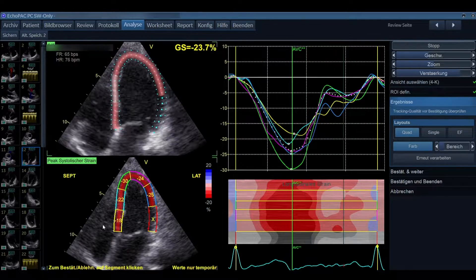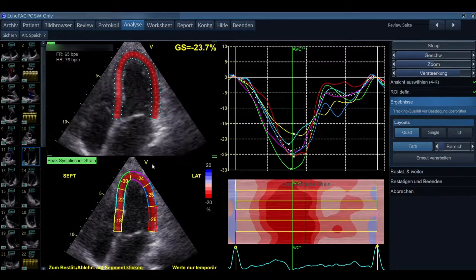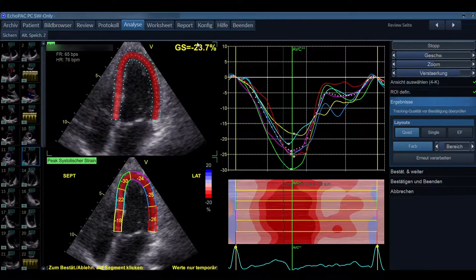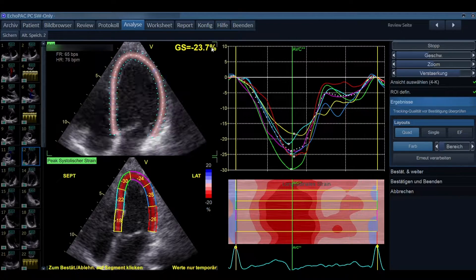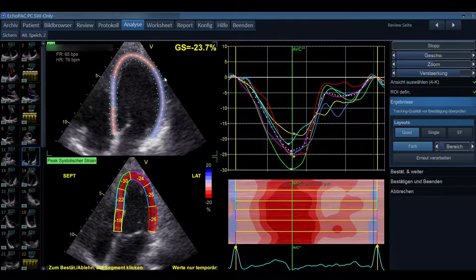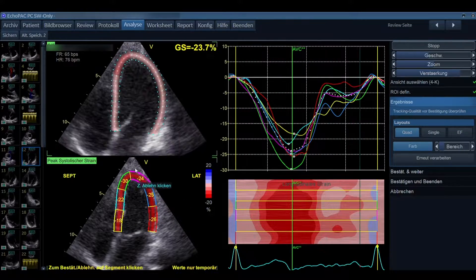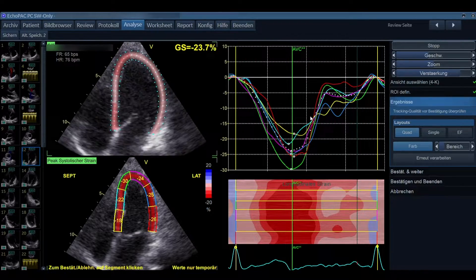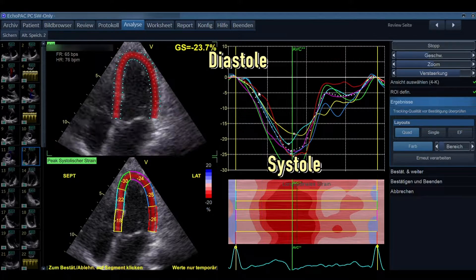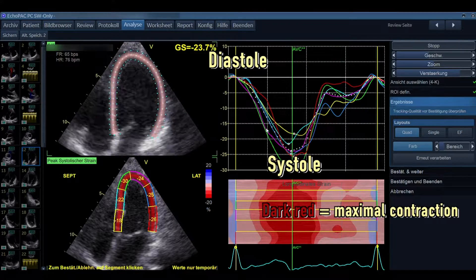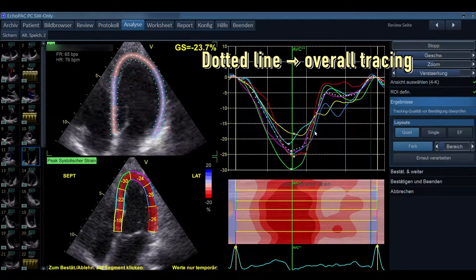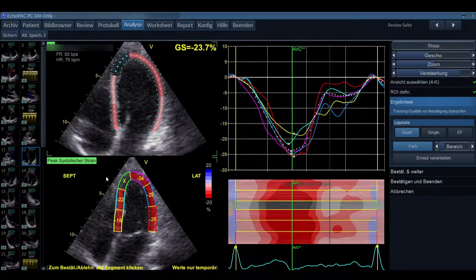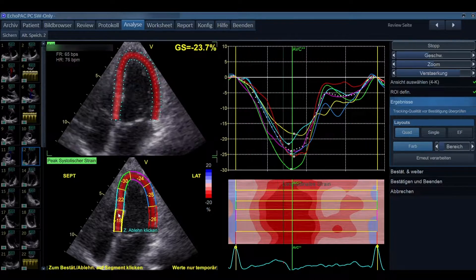Once optimized, we can see the tracking is done nicely. The global longitudinal strain of the four chamber view is minus 23.7%, which is normal for a young healthy individual. We see that all maximum strain values are in the very red or dark red areas, which is normal. In the strain M-mode, we see nice curves delineating diastole and systole — this dotted line is the overall tracing with all curves combined.